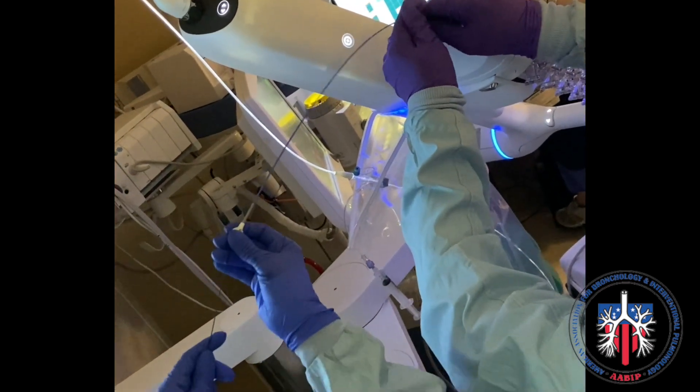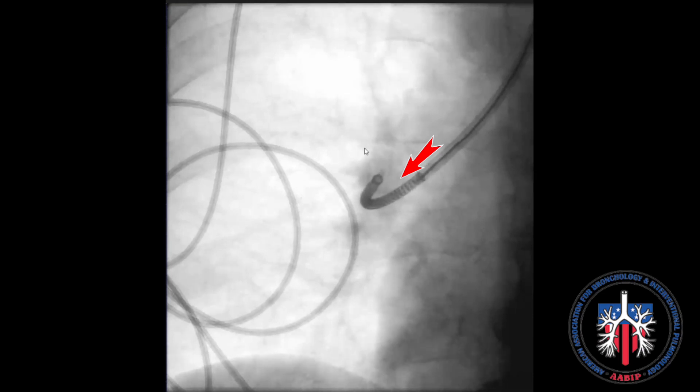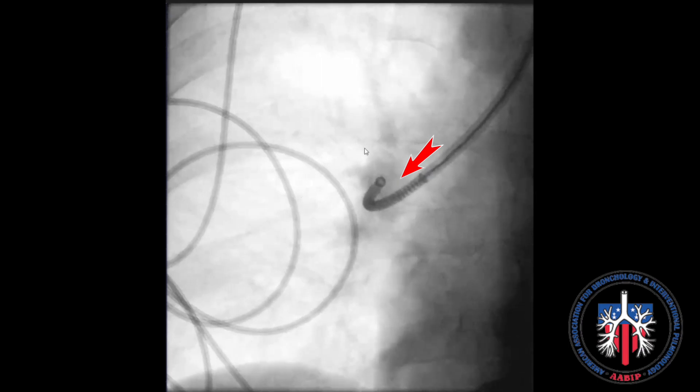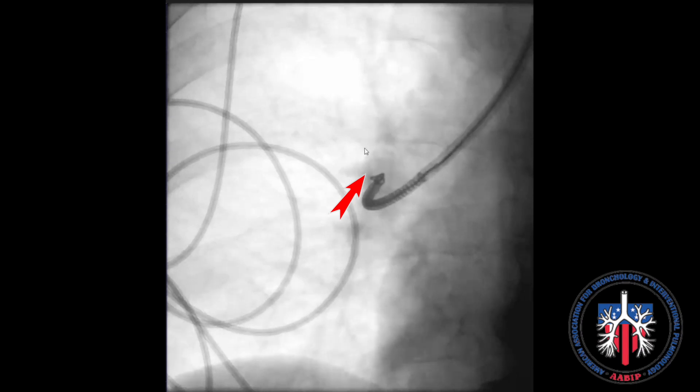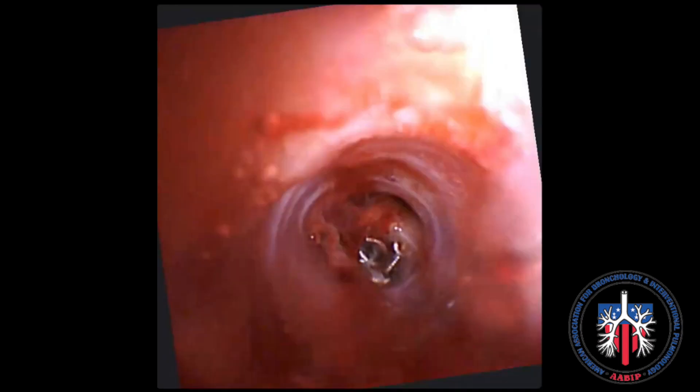The catheter is advanced to reach the tip, and then the coil begins advancing out of the catheter through the loading catheter with a push of the guide wire. The coil is straight within the catheter but, when deployed, starts coiling within the lung nodule after the diagnosis, forming a coil formation within that nodule. When the push is complete, you can see with the vision probe the coil in the lesion.